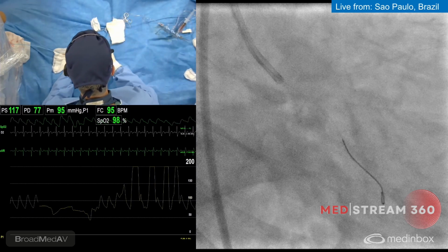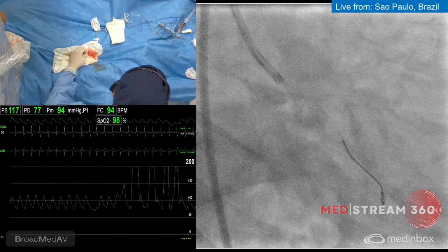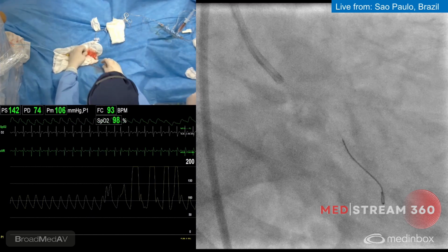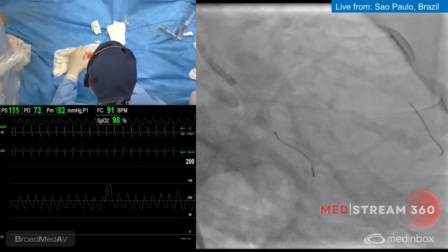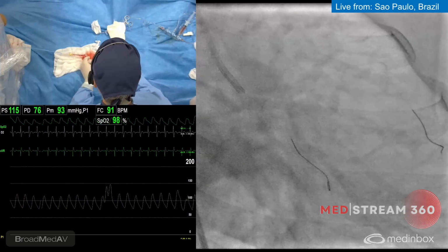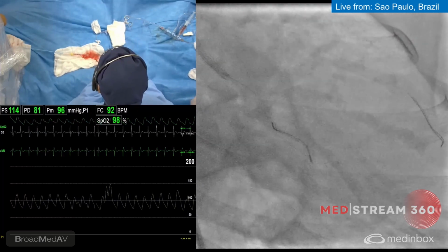So what size of stent are you gonna use? The size of stent that we have there, we have measured and taken the less diseased segment based on what we saw by IVUS here. We pick a 3.0 by 33. So you're gonna go up to the ostium. Provisional technique.